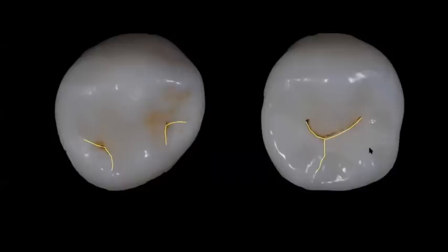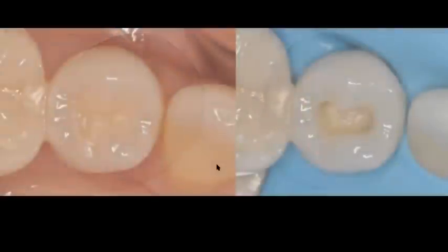Look at what the patient has on the other premolars and try to reproduce those based on the current anatomy that they are presenting. So I'm going to walk you through maybe a couple of cases where I'm using these concepts of essential lines, which again is no other than the actual occlusal anatomy that we learned when we were in dental school, and applying those concepts to my layering techniques so that my end result looks like those essential lines.